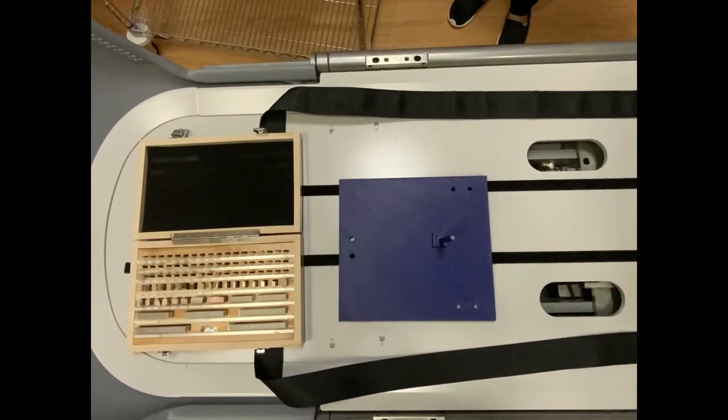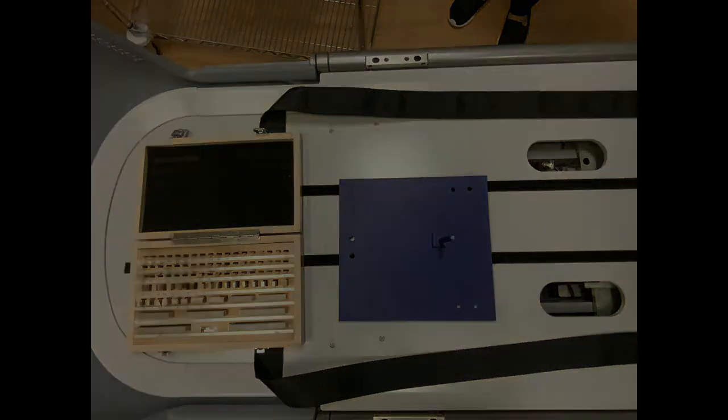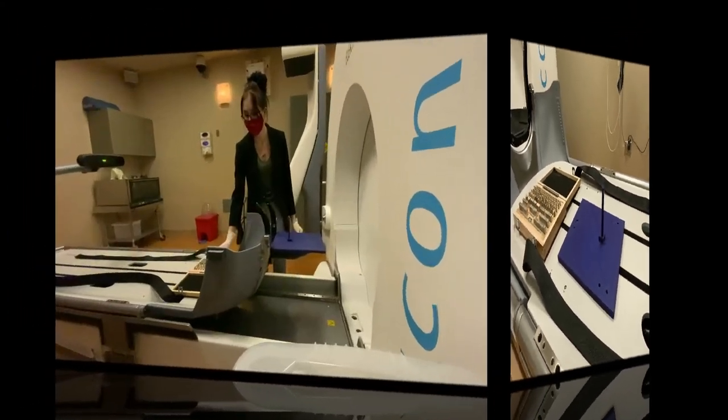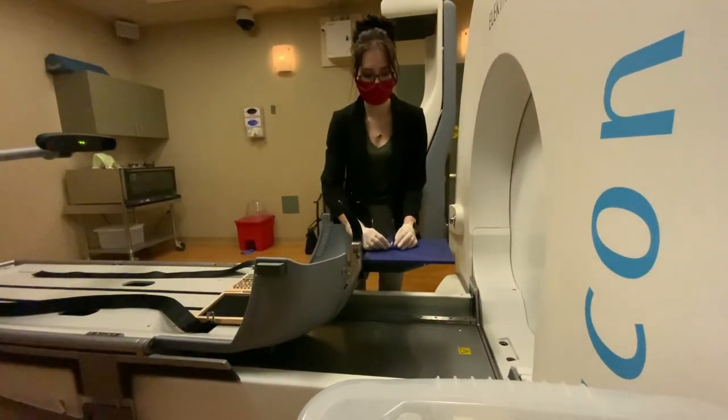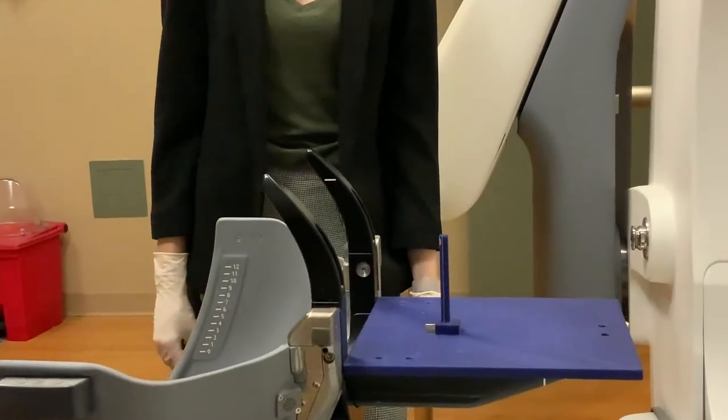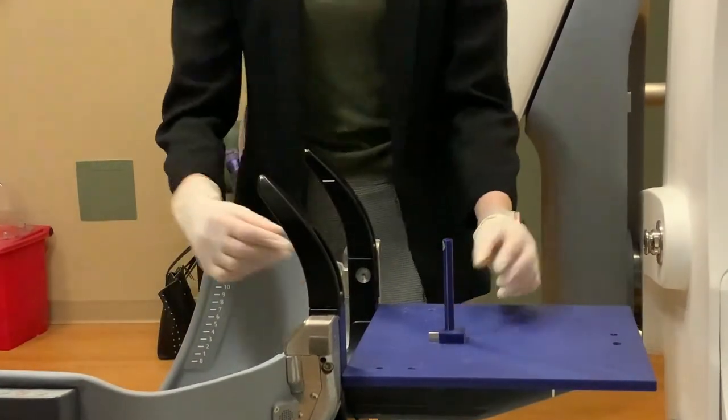Gauge blocks were used to set a standard distance and have accuracies of less than 0.4 micrometers. A gauge block is inserted in any of the X, Y, or Z directions and the HDMM system's measured shift is compared against the block thickness.